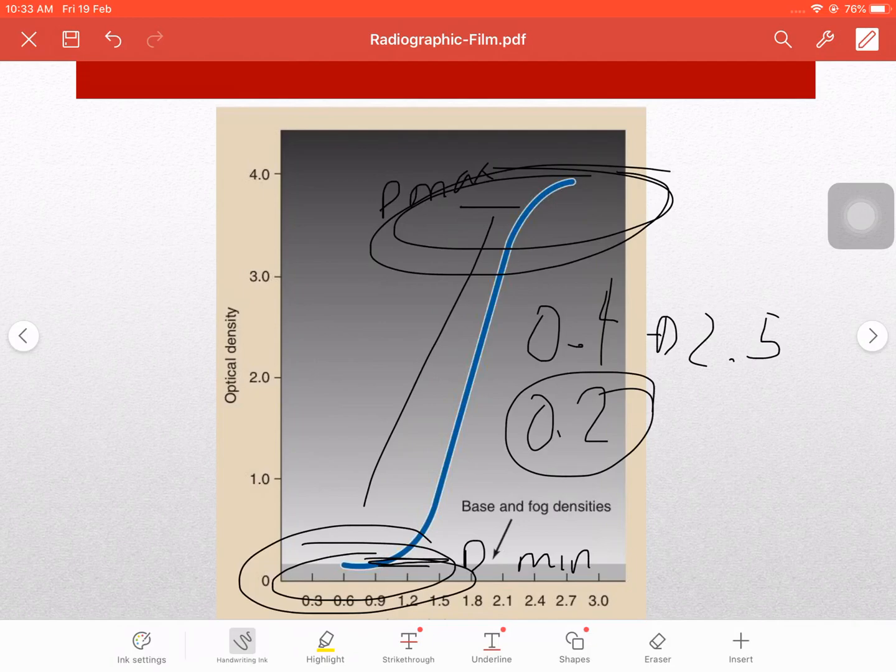There is a region of solarization. Region of solarization is the density on the film that begins to decrease with increases in exposure. So, dito sa part na to, this is your region of solarization. Once it reaches its maximum density, bumababa yan, even na-reach nyo yung maximum na log relative exposure. Even if there is an increase in exposure. So, it is caused by the shoulder, by the straight line portion.